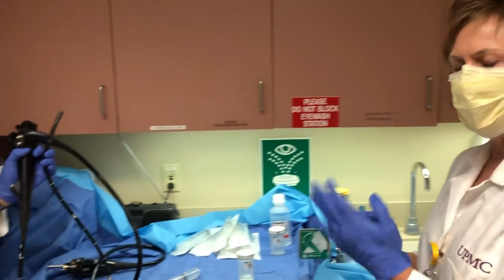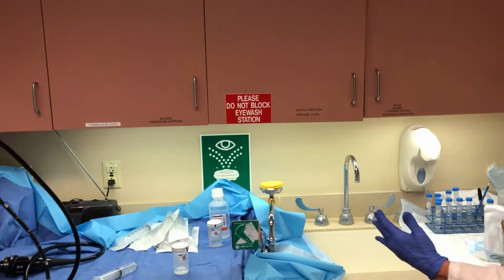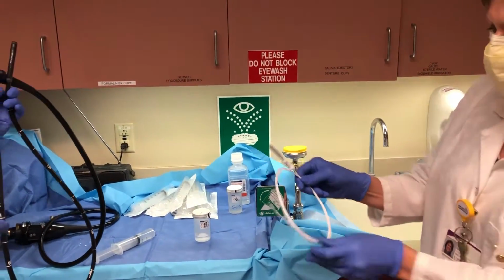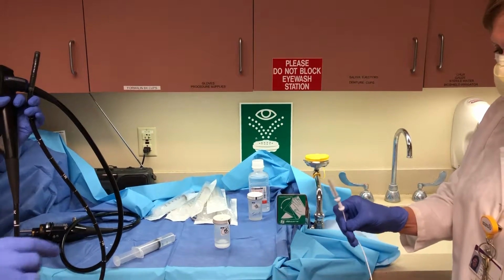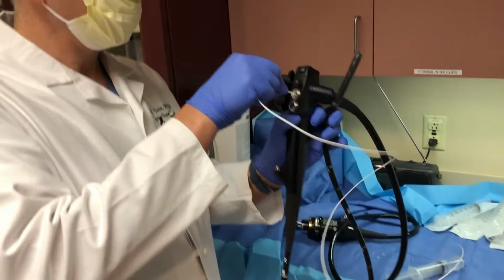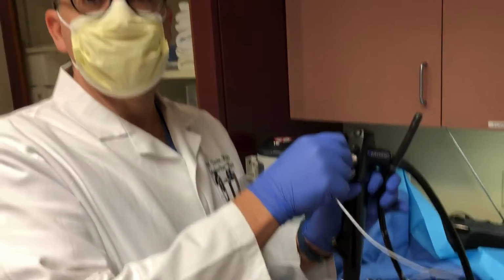So the basic is flush, brush, flush. So we just did our first flush. Now we're going to take our endoscopy brush, keeping it sterile, uncoiling it if possible. It helps to feed through the lumen of the scope if it's not twisted. So this is the biopsy channel.